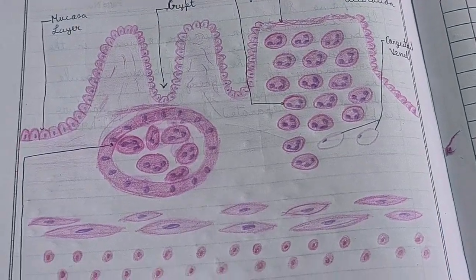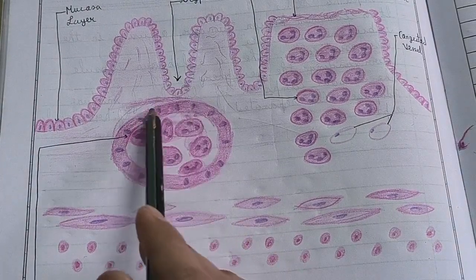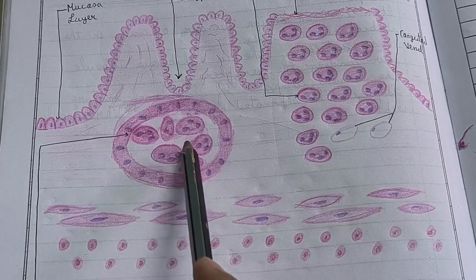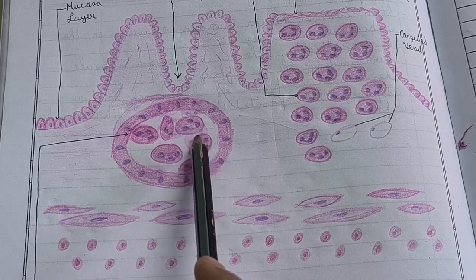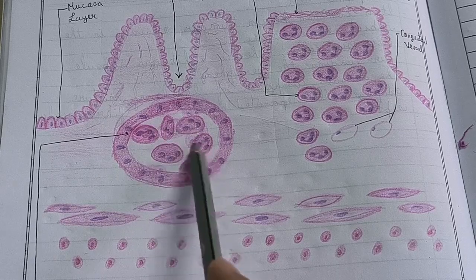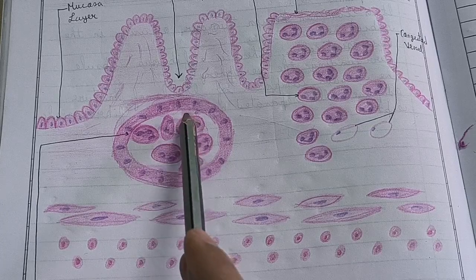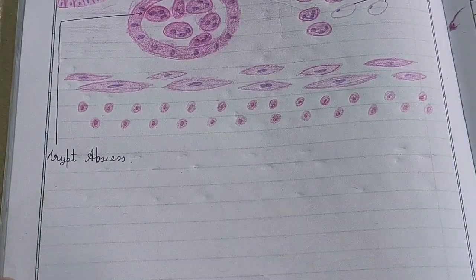Now, as you already know, in the crypt region the crypt gland is found, but you also know that in the lumen of the crypt gland no cells, no neutrophils, are found. But in this pathological condition, you can see that in the lumen of the crypt gland neutrophils are found, and this accumulation of neutrophils in the lumen of the crypt gland is known as crypt abscess.